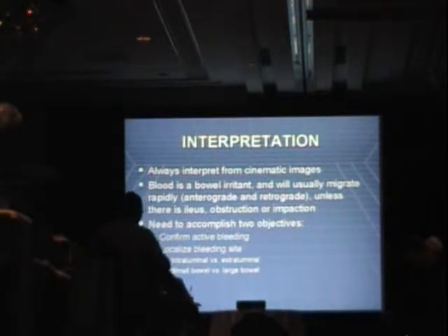Always interpret these studies from the cinematic images. You can be fooled by just looking at a static image. Remember that blood is an irritant to the bowel and it usually migrates both antegrade and retrograde on these studies. So once it's gone on for a while, you may not determine the bleeding site anymore if you just see blood filling the whole bowel.